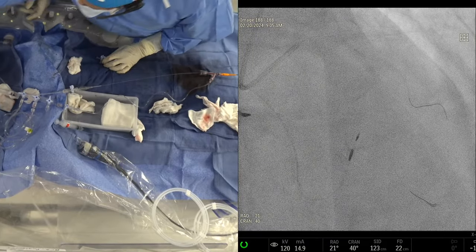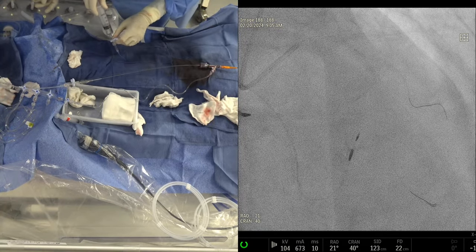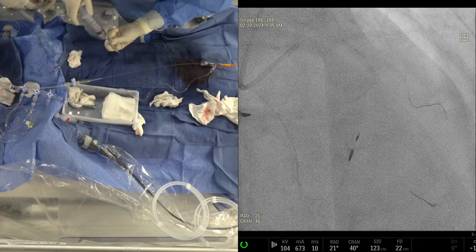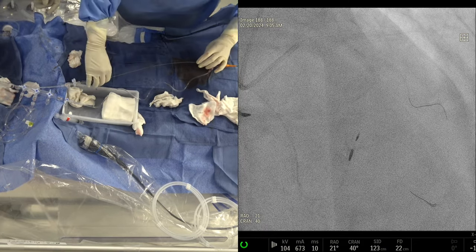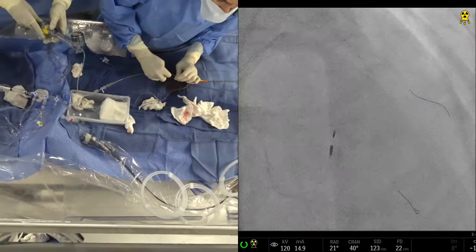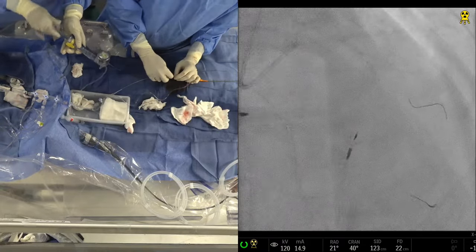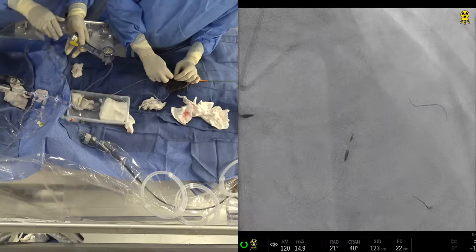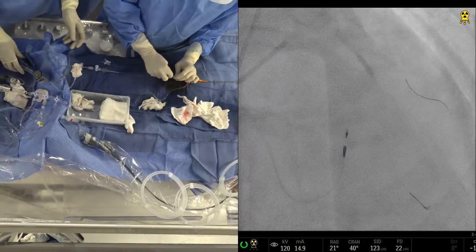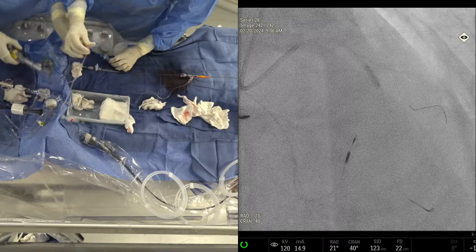Give me the LAD. I can go anchor, except that's a 12 balloon. We may be a little distal. When you're anchoring and going outside the stent length, go there at low pressure. And you can get a new 1.5 also if needed. Okay, good. It went in anyway. See, that anchor technique helps quite a bit in many of these cases.